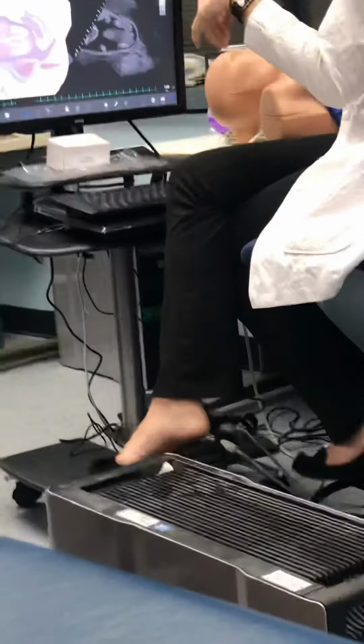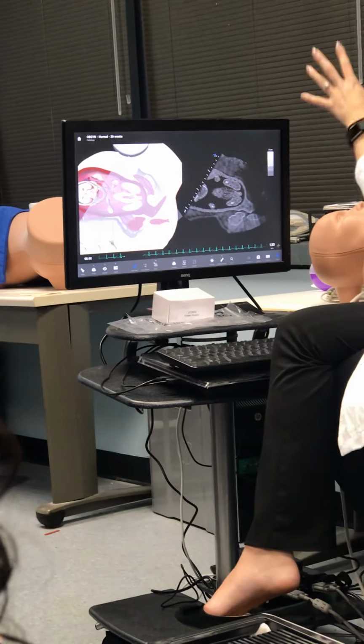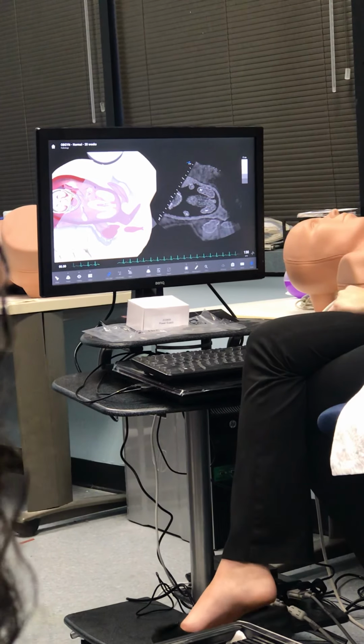So I'm wanting to show sagittal, maternal long axis, what is closest to that? Your breech. Butt. We are breech currently, yes. My butt is currently closest to cervix. So we are in the breech presentation.